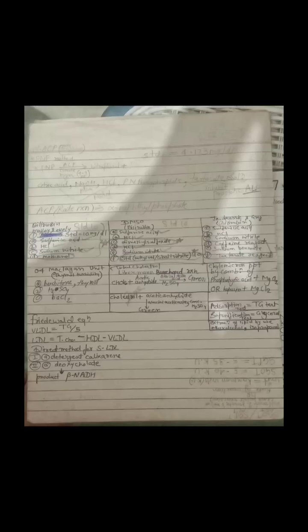Here are the tests: total cholesterol, triglyceride, glycerol, chylomicrons, bilirubins and some formulas. Firstly, total cholesterol, the reaction is the Liebermann-Burchard reaction. The equation is cholesterol reacts with acetic anhydride in the presence of glacial acetic acid and sulfuric acid and forms a green colored compound.